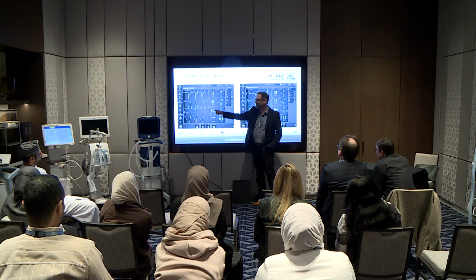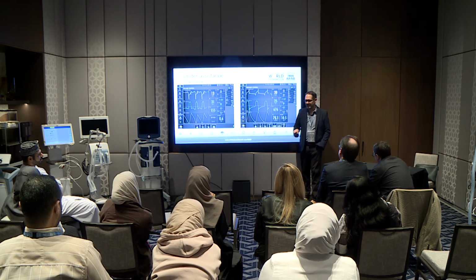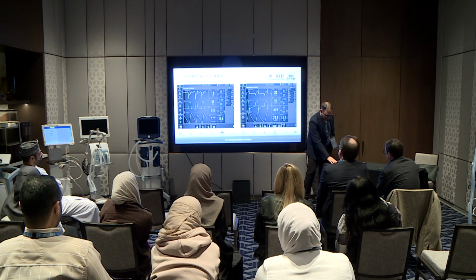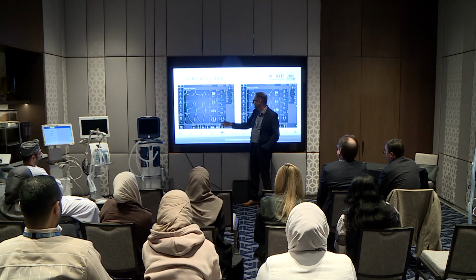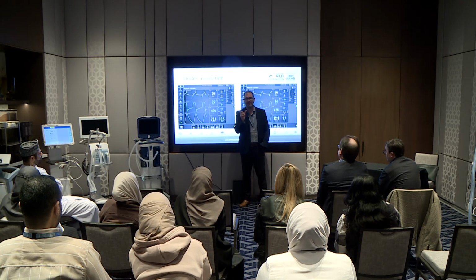So this patient clearly was uncomfortable. We switched to pressure. We still can't control her tidal volume. She's only getting pressure control of 6. And she has ARDS. That's why we sedated and paralyzed her and proned her. But I'm going to take this picture and put it over there. What other problem do you see? So clearly it's under assistance because huge drive, low support. I told you why we can't assist her more, but what can you tell me about the timing?